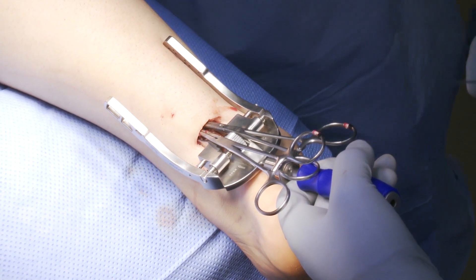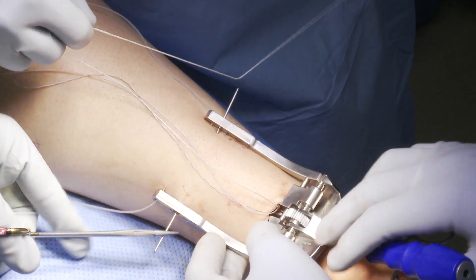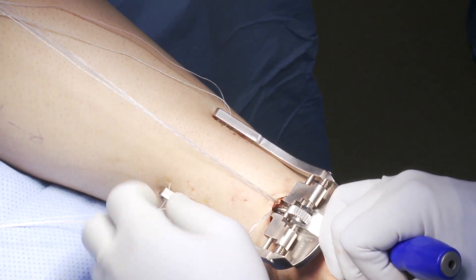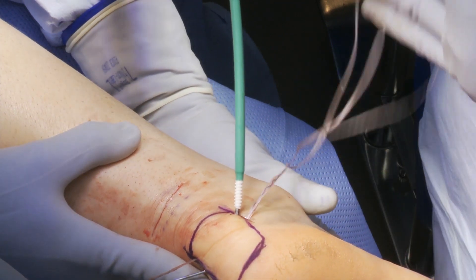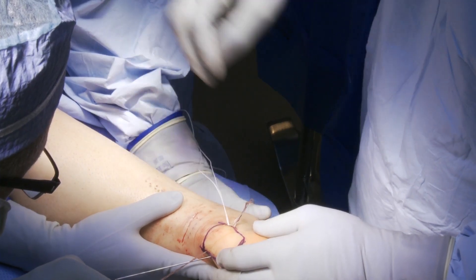What was it that intrigued you about the Arthrex solution for this pathology? With the small incision approach I can protect the surrounding soft tissue, get locking stitches into the proximal Achilles with the suture tape locking stitch, and then anchor that distally, avoiding the complications that come with knots. We know from the literature that knots, even tied by the best surgeon, have a variable result and can sometimes loosen. So what's wonderful is that there is a knotless approach with the Achilles mid-substance speed bridge, where those sutures from locking stitches proximally can be locked into bone with a swivel lock, so that I don't have to worry about making my repair sub-optimal.